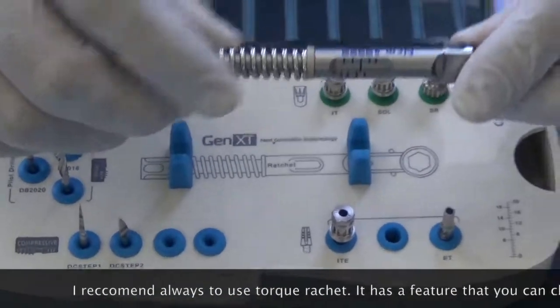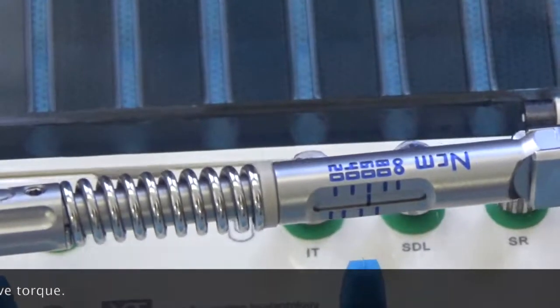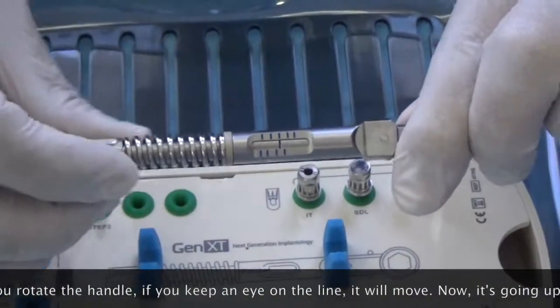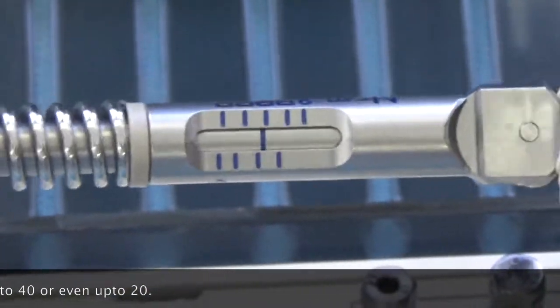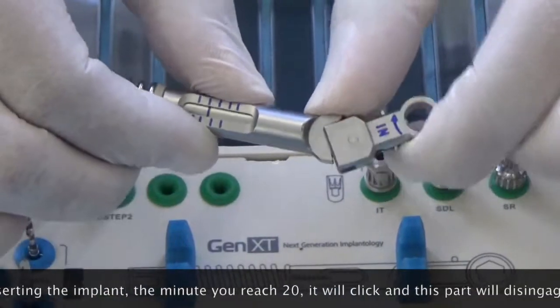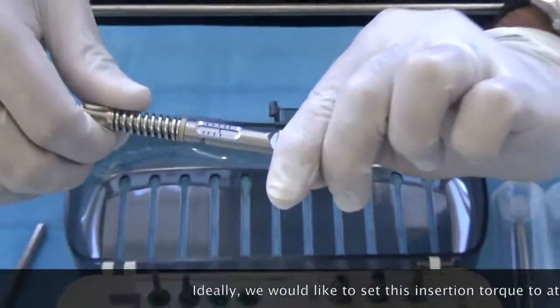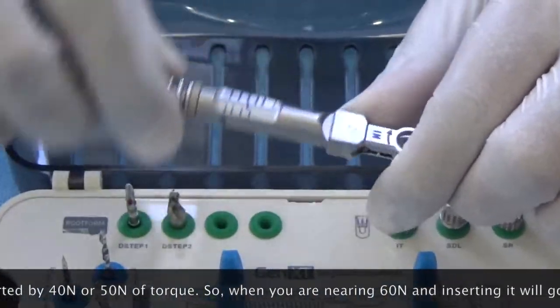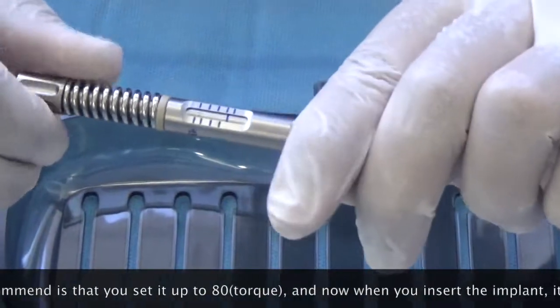I recommend always using the torque ratchet. The torque ratchet lets you check the insertion torque and also protects from excessive torque. When you rotate this handle and keep an eye on the line, it moves — it can go up to 80. Moving it anti-clockwise lowers it down to 40 or even 20. While inserting, the minute you reach the set torque, this part will disengage and click. Ideally set the insertion torque to at least 60, since most implants are inserted at 40–50 Ncm.